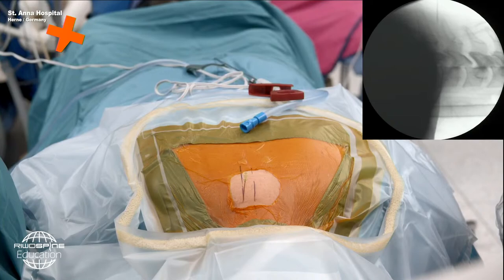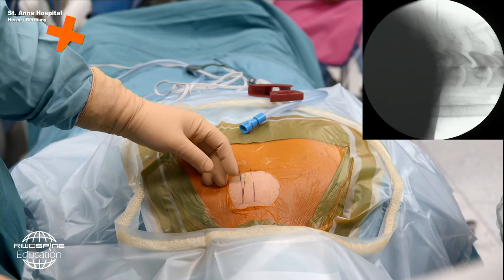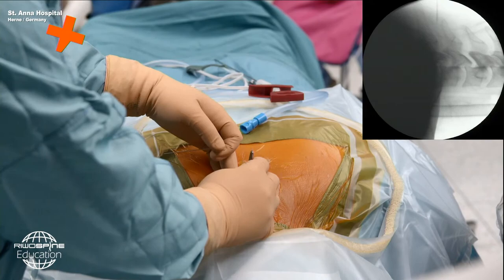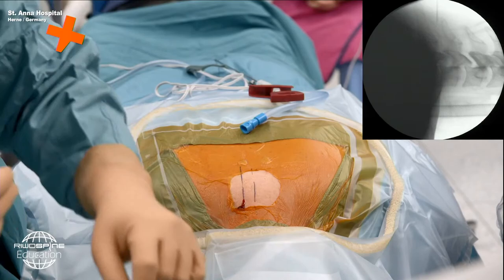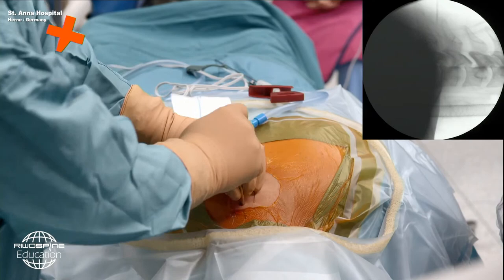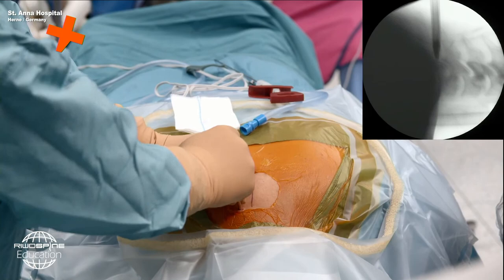So we mark just our entry point for the skin incision, and then we remove the needle and do the skin incision in the line of the middle of the lateral mass. Okay. Then we insert the dilator. Feel already bone here.